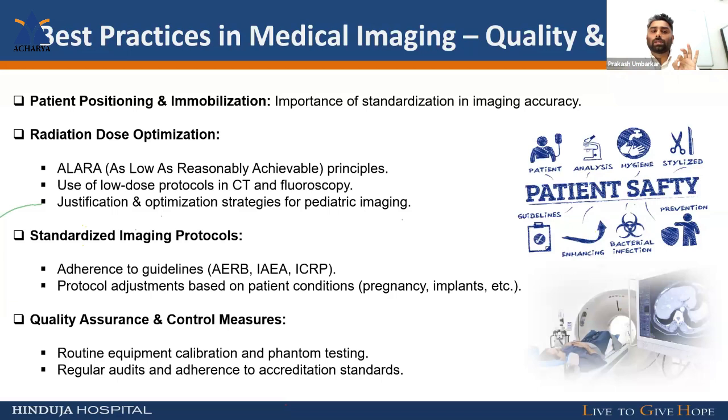Radiation dose optimization. Don't forget the ALARA principle. Use low dose protocols for both CT scan and fluoroscopy imaging. Try to minimize the radiation dose to the patient, and apply justification and optimization strategy in the pediatric patient. What purpose are you taking this imaging for? Will it really work for this imaging purpose?